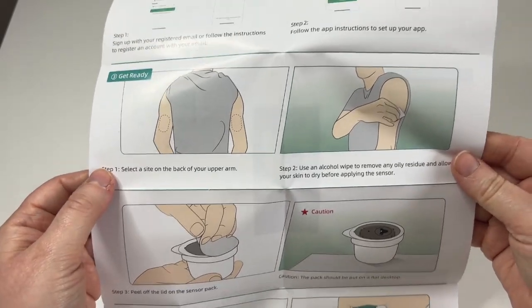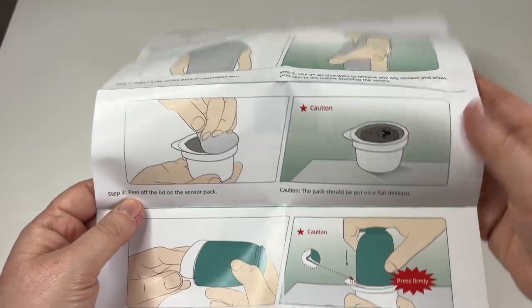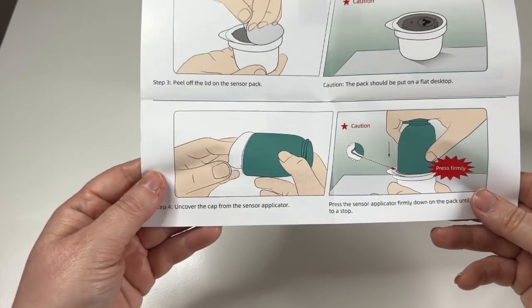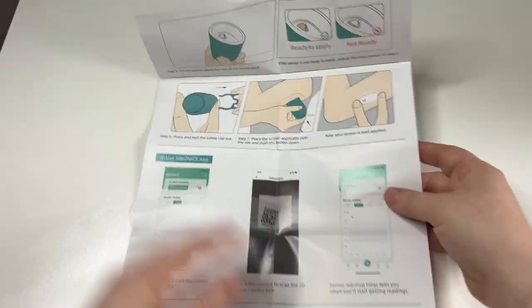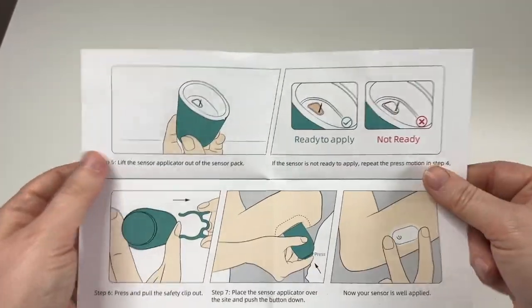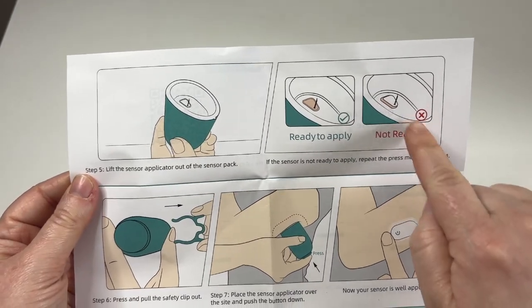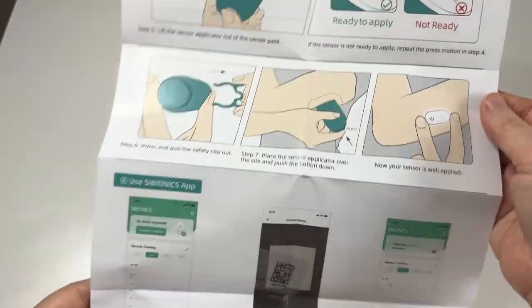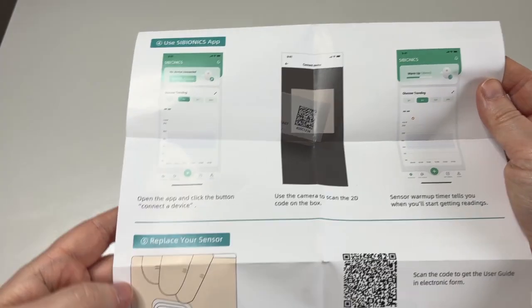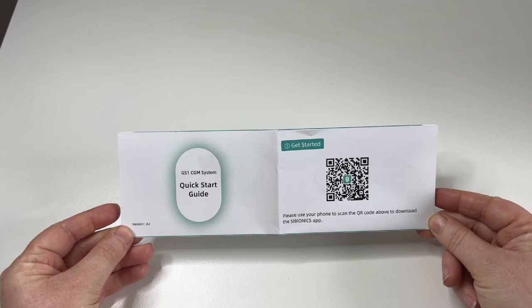So: select a site on the back of your upper arm and use an alcohol wipe to remove anything. Peel off the lid of the sensor pack — it should be put flat. Take off the cap from the sensor applicator and push it back down firmly on itself. Lift the sensor applicator out of the pack. Peel off the safety pin, put it on the arm and make sure it's well applied, then scan it using the app. I think that seemed very straightforward — I remember struggling with the Dexcom a lot.